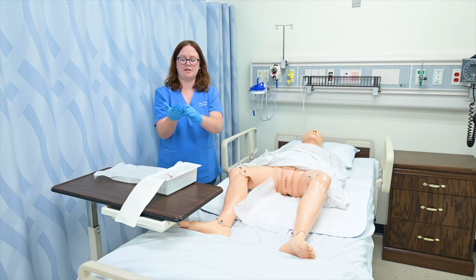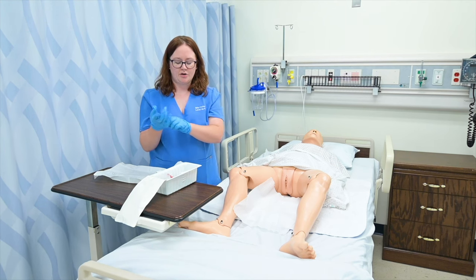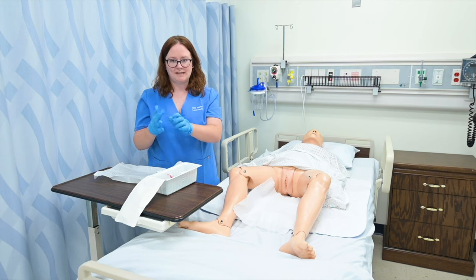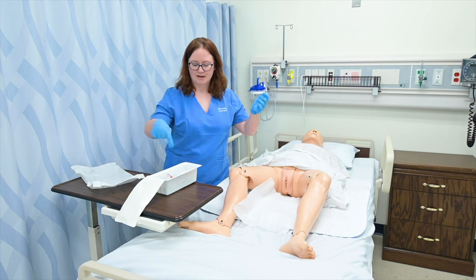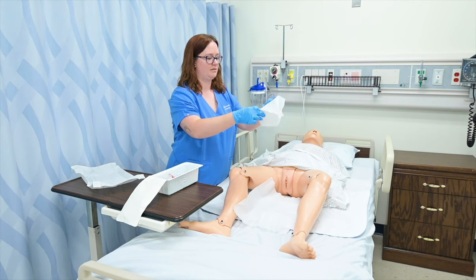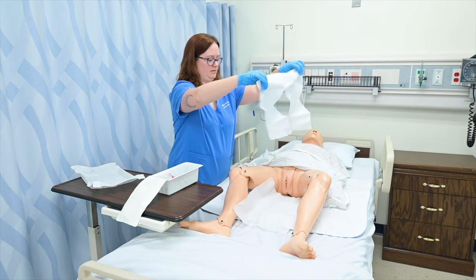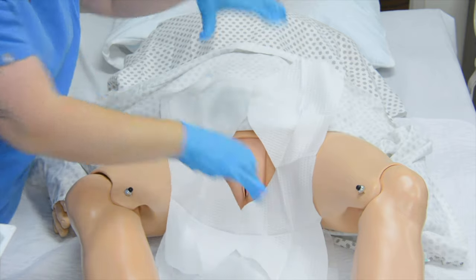All right, and then the procedure is actually almost identical to an indwelling catheter, right? I'm gonna do all the same steps up until leaving it in their bladder, right? So I'm going to get my fenestrated drape and place it over their labia.